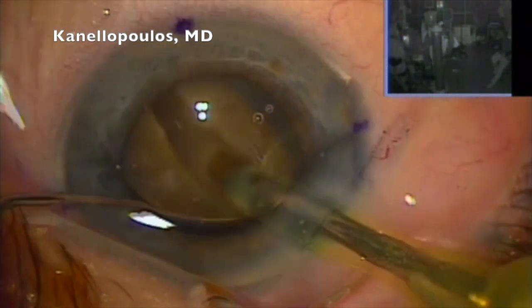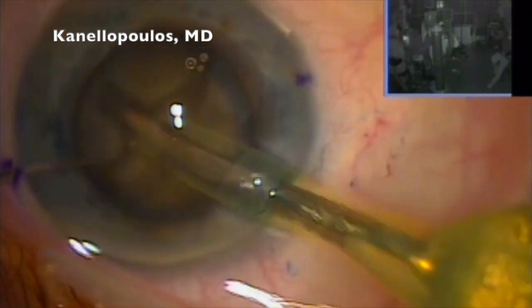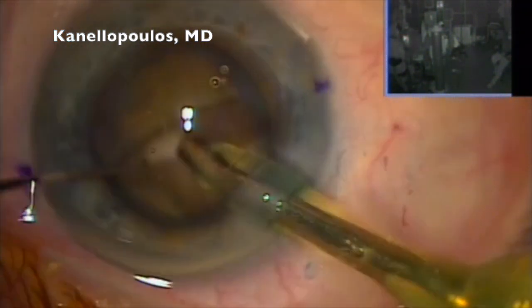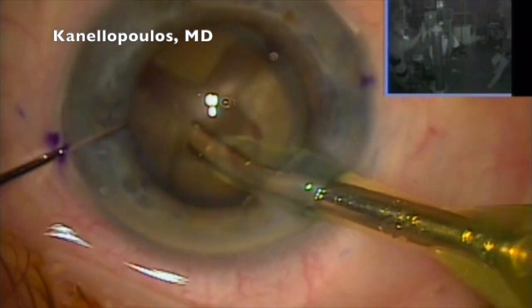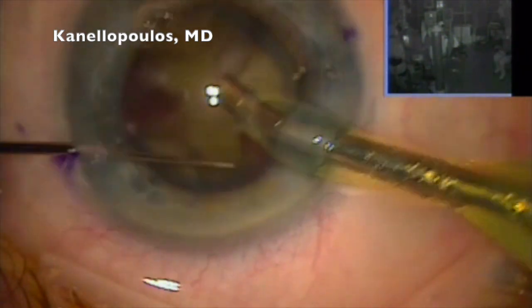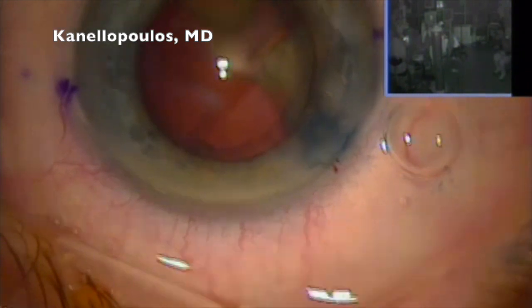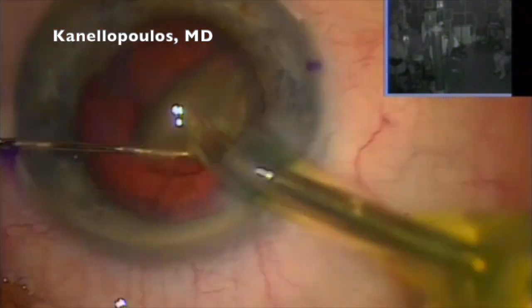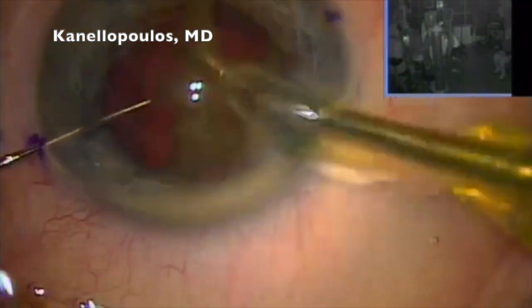We need to give time here. The lens is very big. It's pressing upon the capsule. The thickness of the lens is over 5 millimeters. So this is a case you want to take your time and not have to spend time picking up pieces from the vitreous cavity. I'm always filling in more viscoelastic, Viscoat. It is a savior for corneal endothelium.